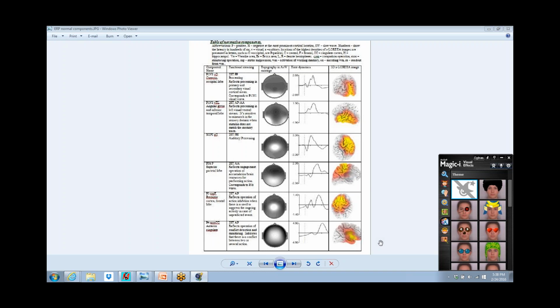Now, theta all over the frontal lobe is like ADD. So, one is healthy, normal, and its spatial and temporal filter ends up being a very discrete burst. It's different than frontal theta. And ICA feedback can tap into the fact that this is a frontal burst as opposed to the ongoing theta in the frontal lobe and feed it back more specifically. So you don't necessarily turn off somebody's memory function as you're dialing down their ADD, for instance.